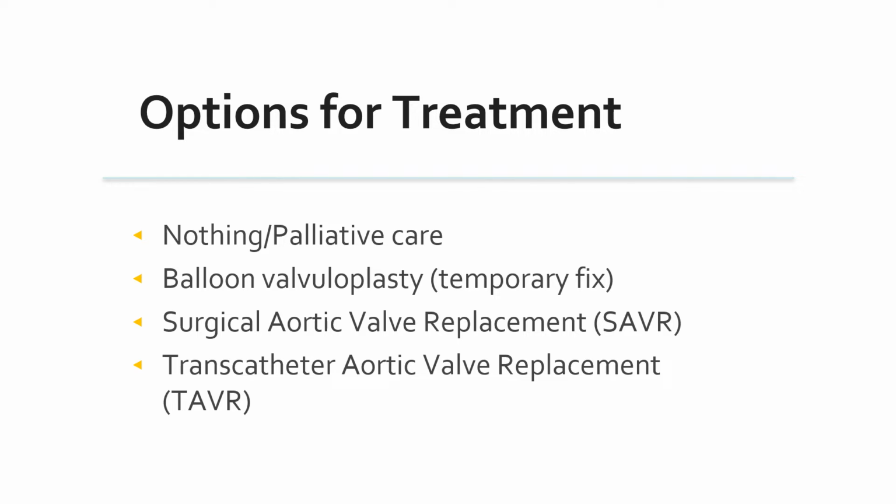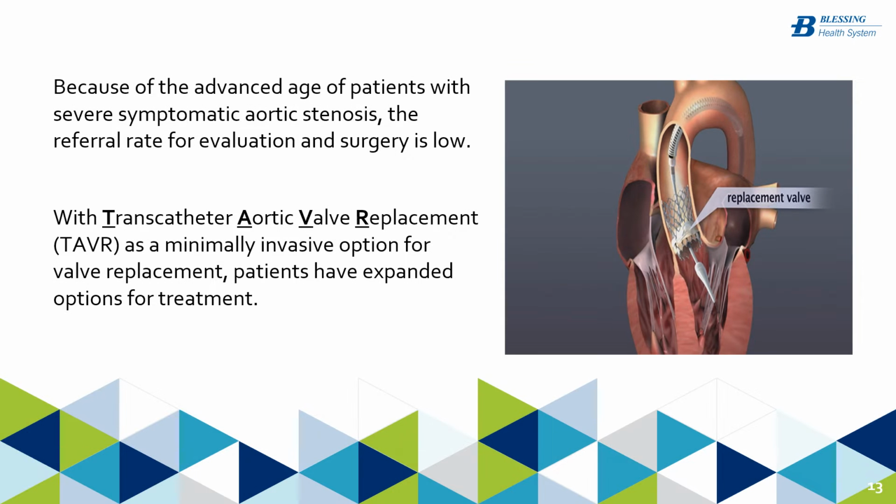So there are several options for these patients. The therapy I want to concentrate on next is this actual TAVR valve replacement.